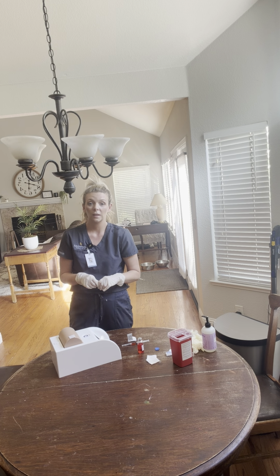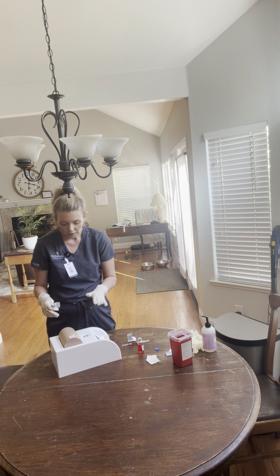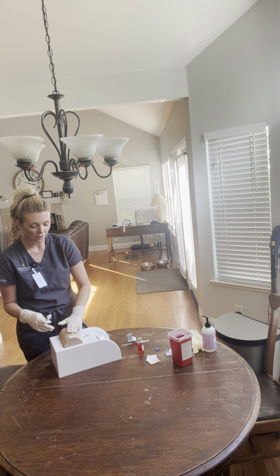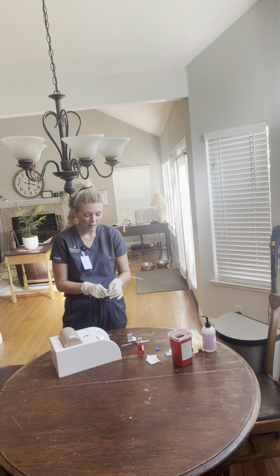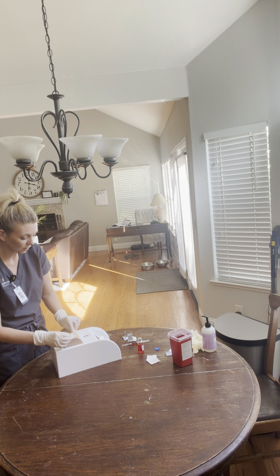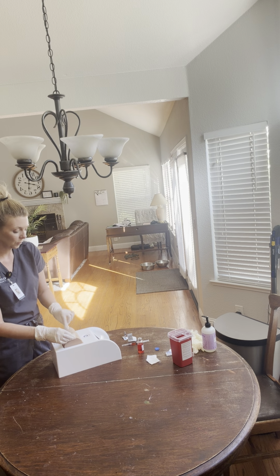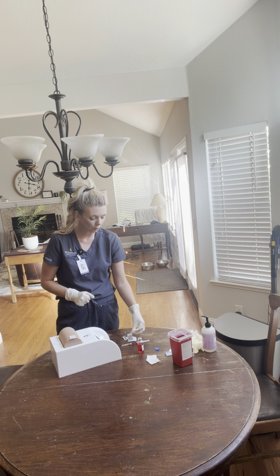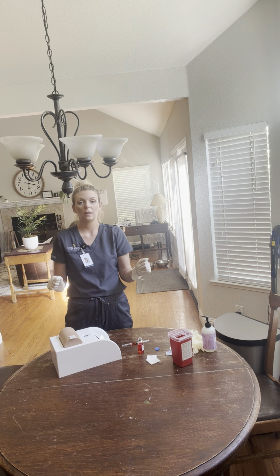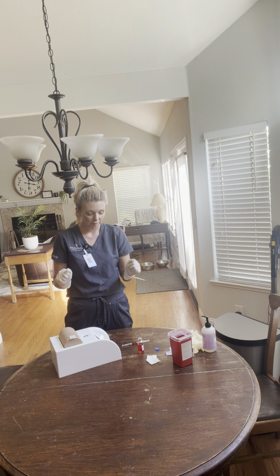My patient's skin integrity is great. There's no open wounds or rashes or bruising anywhere. I'm going to slightly palpate the skin and see if there's any tenderness or pain, and my patient is okay. I'm going to grab my alcohol swab, and I'm going to clean the area in a circular motion, going 2 inches out from the injection site, and I'm going to replace my marker there. It's very important that we let that air dry, not wave it or blow on it, so that sterilization is not broken. So I have my marker there.